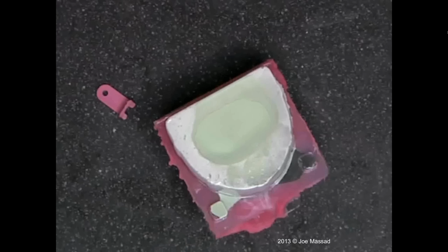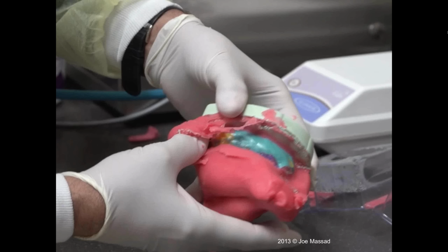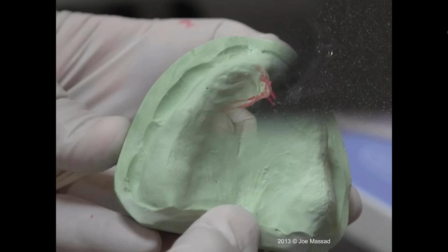So take the glove, just take all this material off, and you'll have to throw part of it away whenever you get little bits of stone in it. But if you do reuse it, then you must disinfect the model. And even in our lab, we use gowns and we use gloves. And you trim it up, and you've got a nice model. Now, I'll make my bases. I go in and take my records, and all in a single appointment.